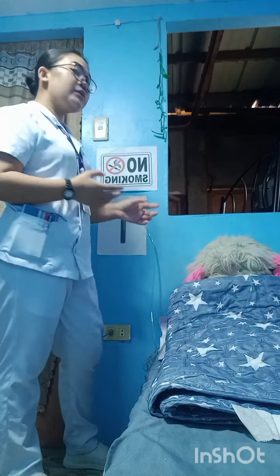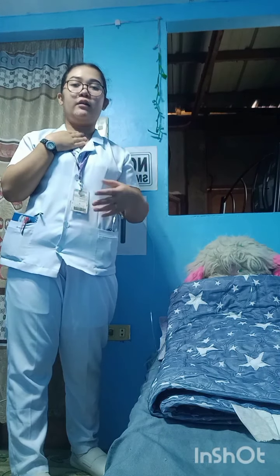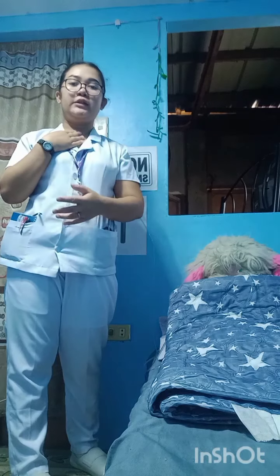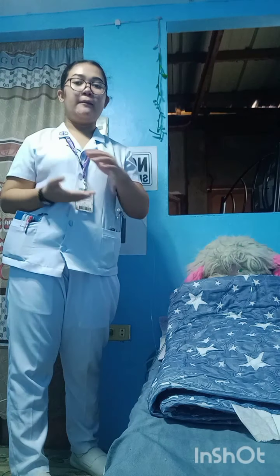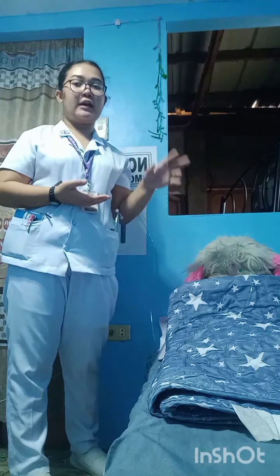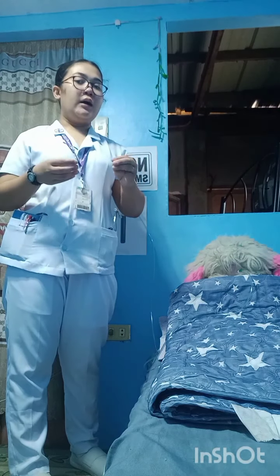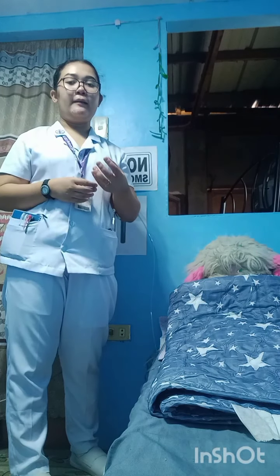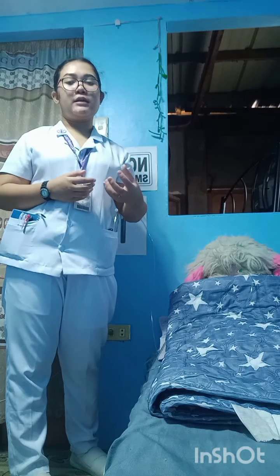Also, yung humidifier naman, yung water sa humidifier, kailangan talaga natin siyang i-check. Kasi, baka ubos na yung water dun sa bottle humidifier natin. Kaya, kapag yung oxygen na lalabas, mainit na siya sa patient. Mainit na paghinga sa patient. Kaya, kailangan natin siyang i-check always, regularly, in every 30 minutes or whenever you're providing care, yung water humidifier natin, na kailangan natin siyang lagyan ulit ng tubig para mag-lessen yung init na binibigay ng ating oxygen dun sa ating patient. Kaya binubuga niya is cold air na siya or hindi ganun kainit.